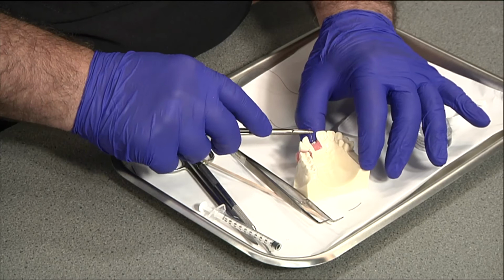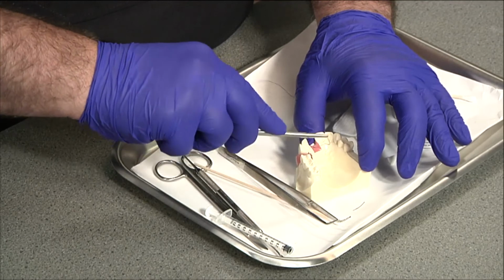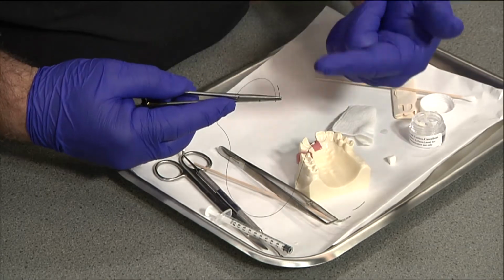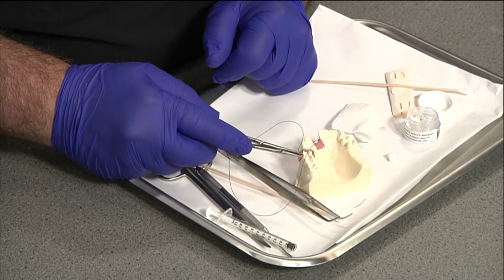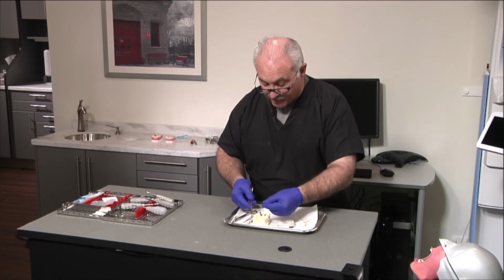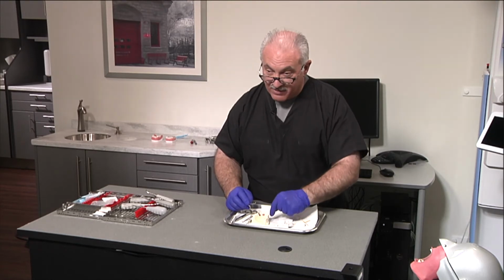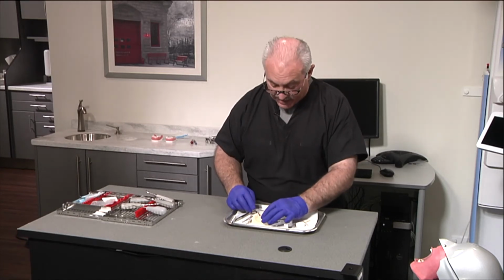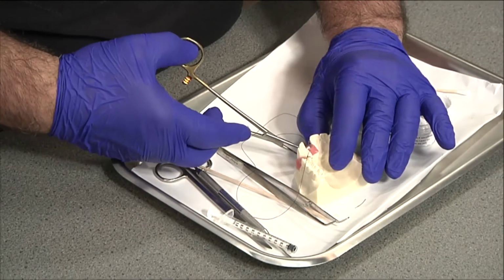Now there is a technique that's been published. You'll see it in a lot of YouTube videos or product demonstrations where you flip that over and tie the margins of the socket repair membrane to the gingiva. That is really good in the very, very best of hands. However, you run the risk, when you're manipulating the tissue and tying the knot, of pulling that out from inferior to crestal. And once you've displaced it, you've lost the purpose of why you're protecting that and rebuilding with that barrier. So I am not an advocate of that.